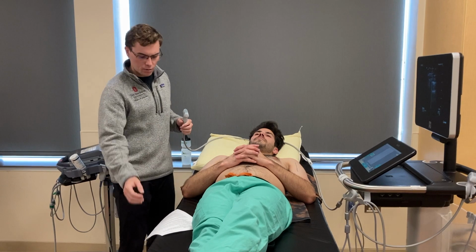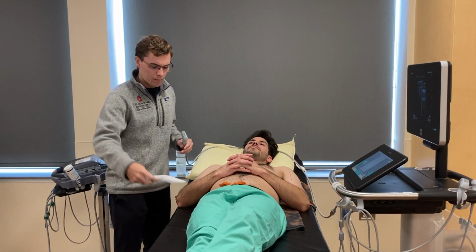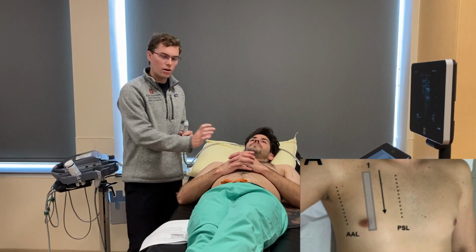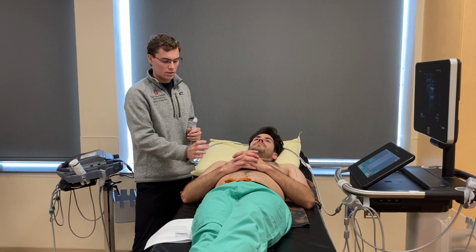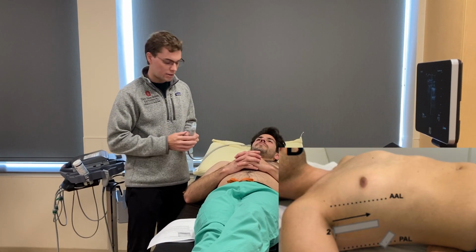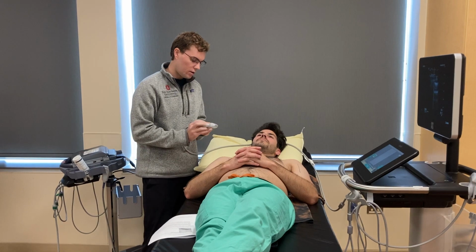So for acquisition-wise, you want to use your linear probe. Several different views you can get on the anterior chest and also on the lateral chest. We'll just focus on anterior here. Use your linear probe, indicator towards the patient's head.